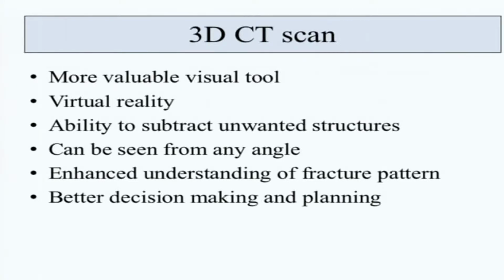This is a very small informal survey that we have done at our institute. We showed the people in our institute the 3D printed slides, the films of this, and asked them for the plan, and then we showed them the 3D model on the computer, and all of them opined that their plan of management would definitely change if they see the things on the computer rather than seeing them on the films. So it really definitely helps in better decision making and planning.